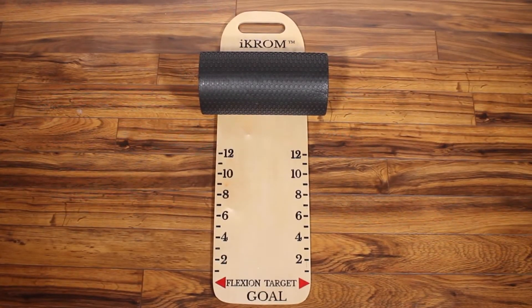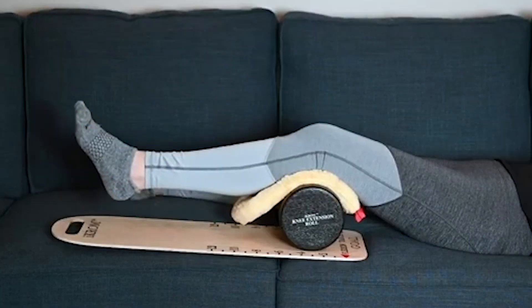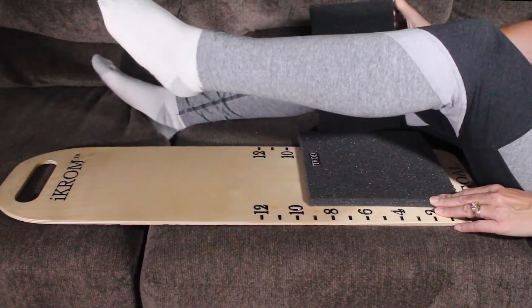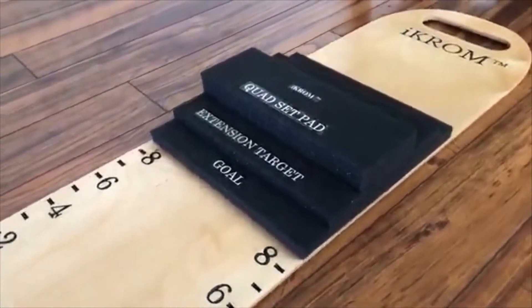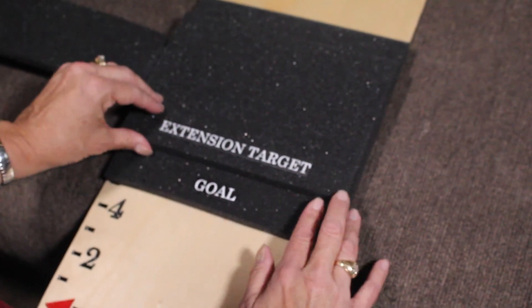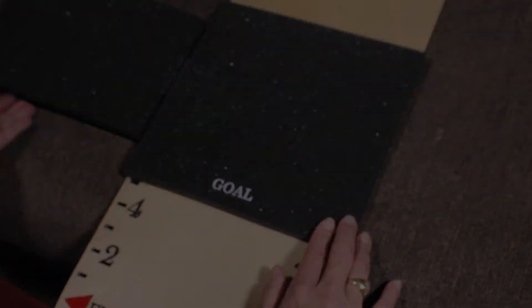To increase knee extension, the ICROM exercise kit has a knee extension role for passive and active knee extension exercises. Also included is a progressive quad set pad which functions as a knee extension target. It consists of three layers of soft high density foam to help activate the quadriceps. The foam layers are removable to quantify progress toward knee extension of zero degrees upon reaching the last layer.